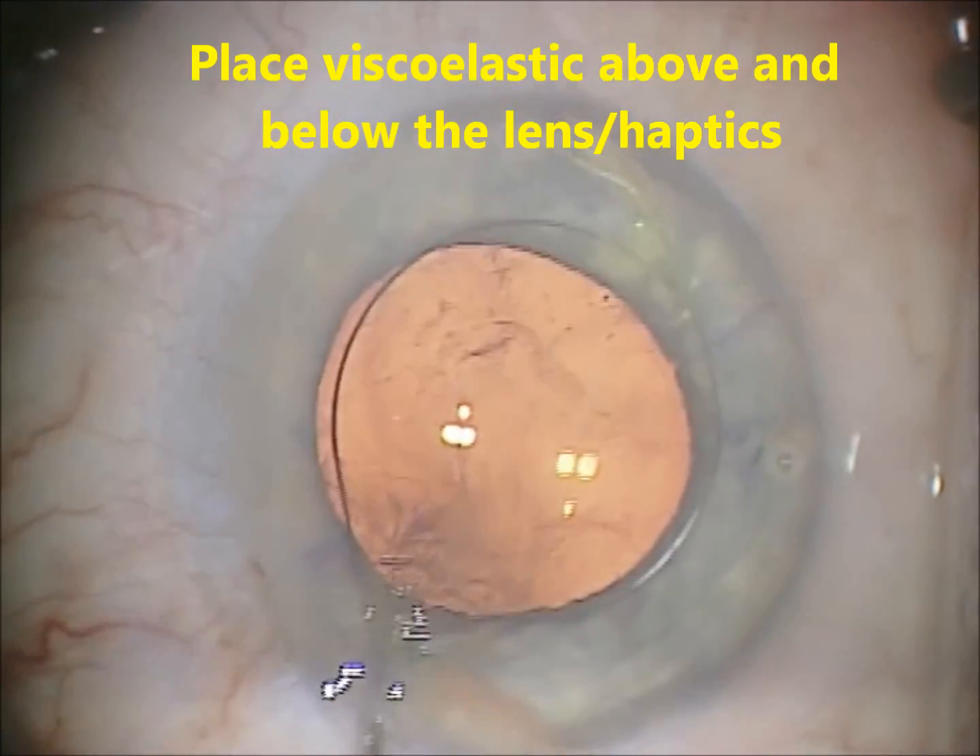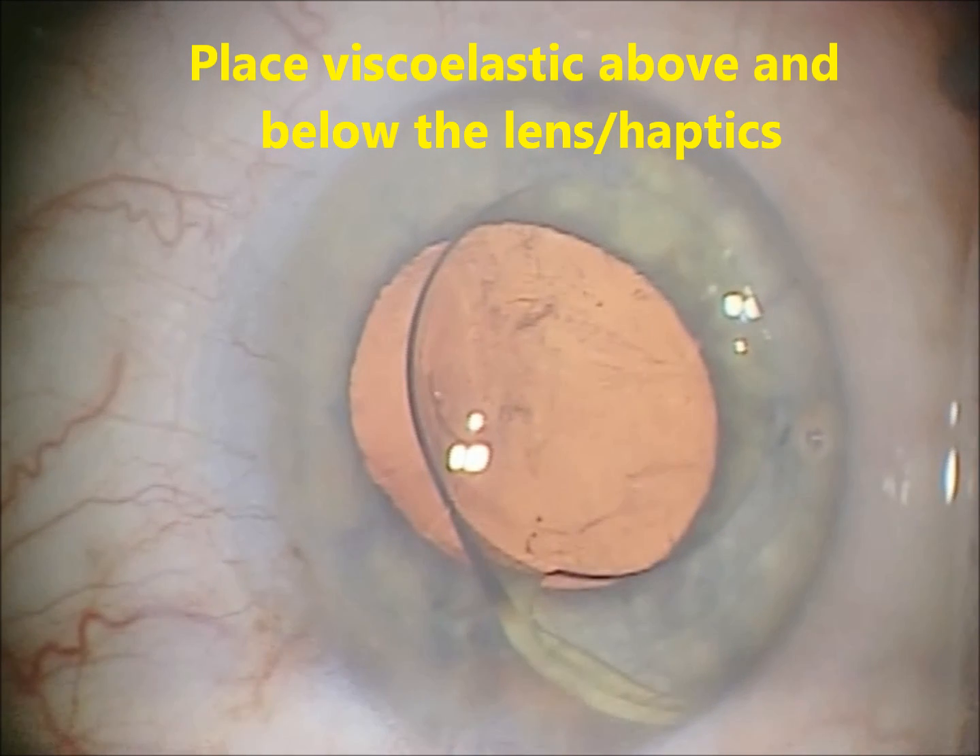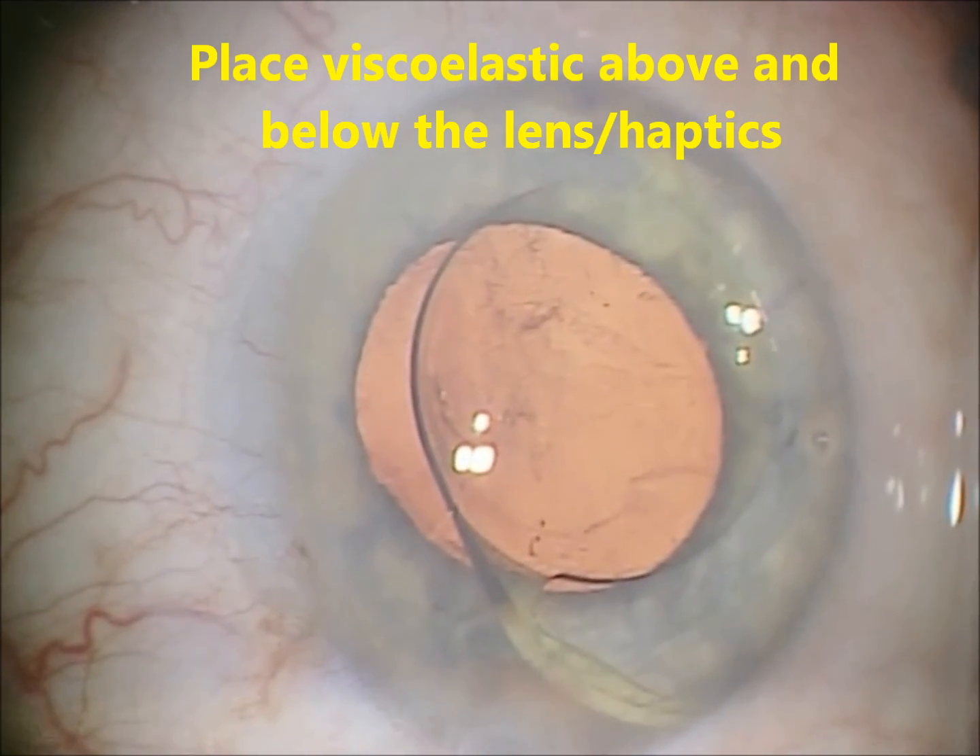Viscoelastic is then placed below and above the lens and haptics to protect the cornea and the bag.